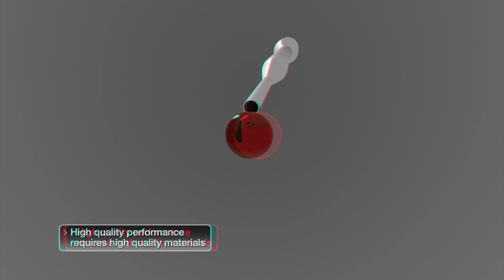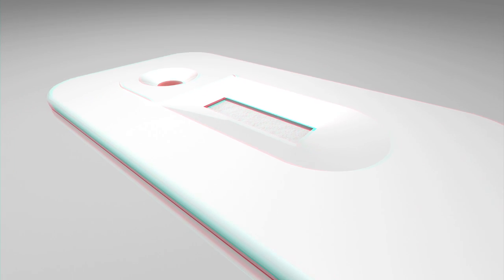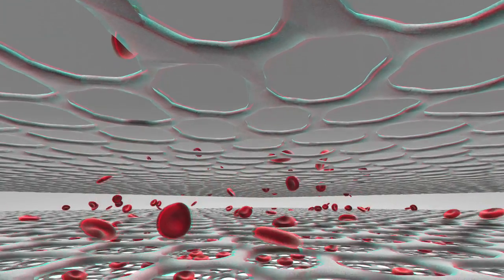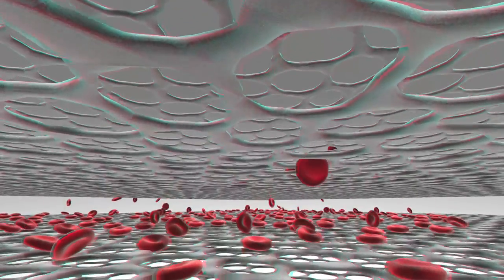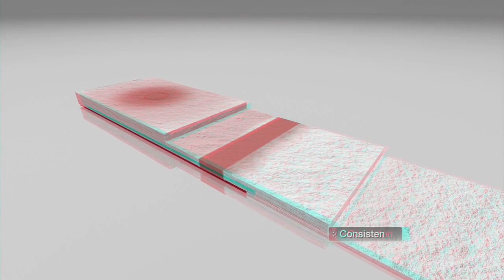To demonstrate the benefits of using good gold, in a typical lateral flow device, a blood sample is deposited into the well and filtered through a series of membranes to remove blood cells, leaving plasma to arrive on the conjugate pad, reconstituting the gold conjugate. Through capillary action, the conjugate is drawn through the membrane.